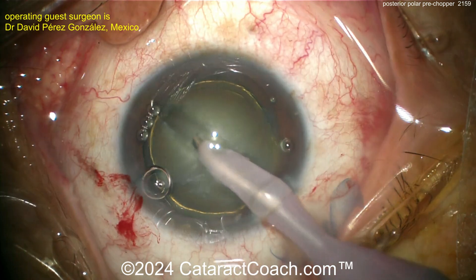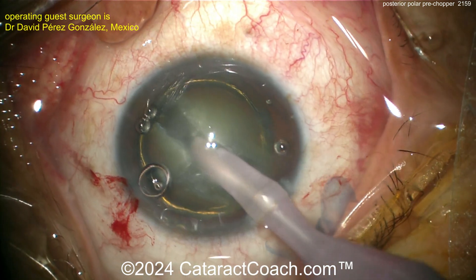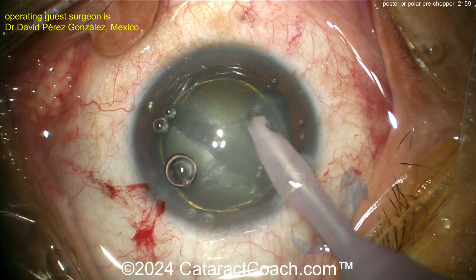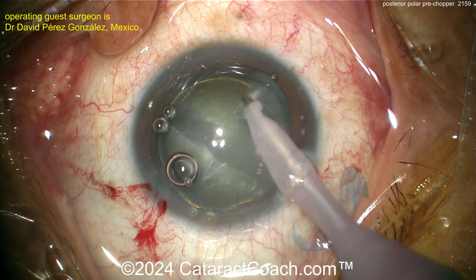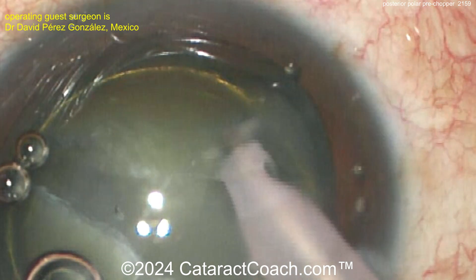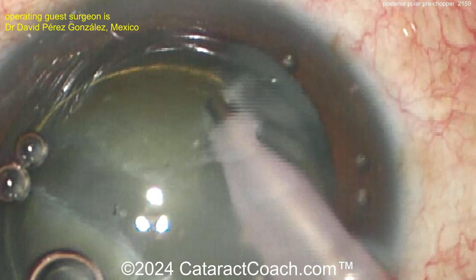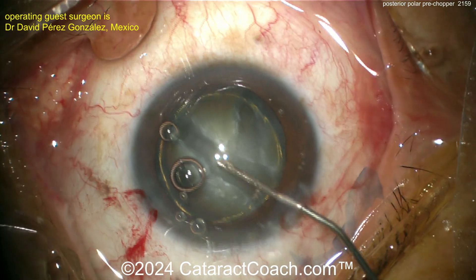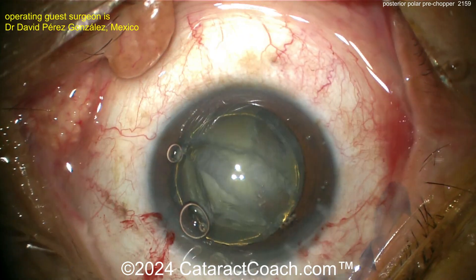That groove looks pretty good. Not aspirating too well — going to the side — oh, what is that? That looks like a smoke sign. Let's slow down. The smoke sign can happen if the tip is clogged. Clear that tip — good catch, great job, doc. More viscoelastic going inside the eye.